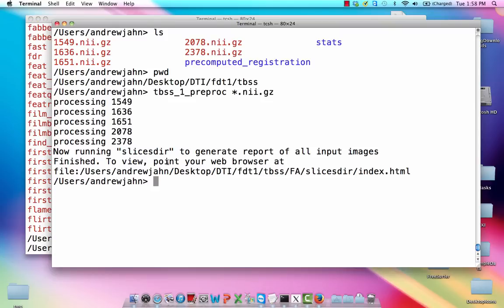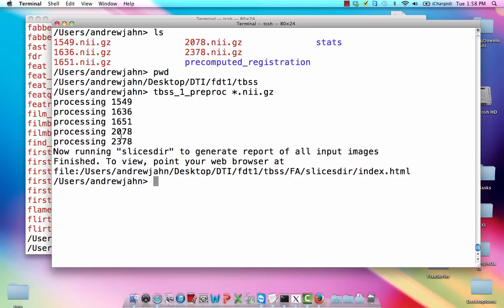Okay. So the first preprocessing step is finished. It recommends using Slices_DIR, whatever's in there, to view what's just happened. And this is an important step in any step of neuroimaging analysis. After you do something, pretty much every time, I'm just going to lay this down as a rule. I don't always follow it, but it's a good thing to just keep in mind and to feel guilty about when you don't do it, is to look at your data after each step. Okay. So that's what we are going to do.